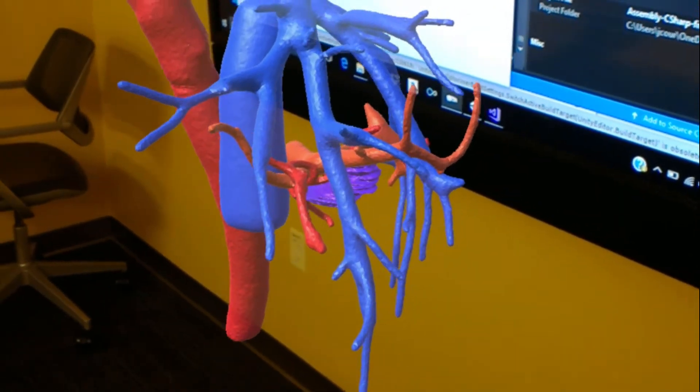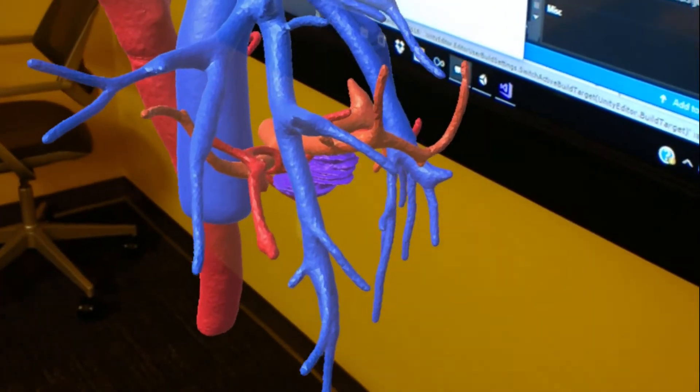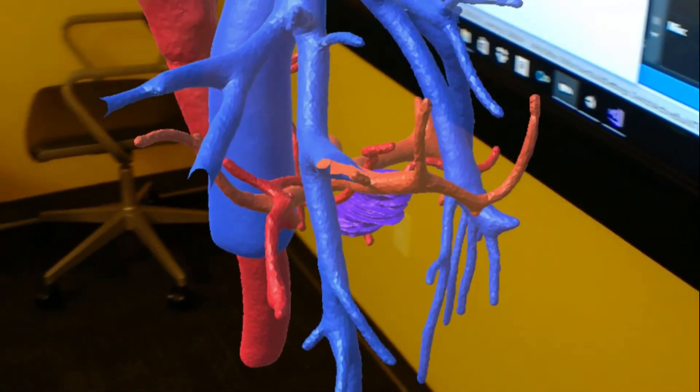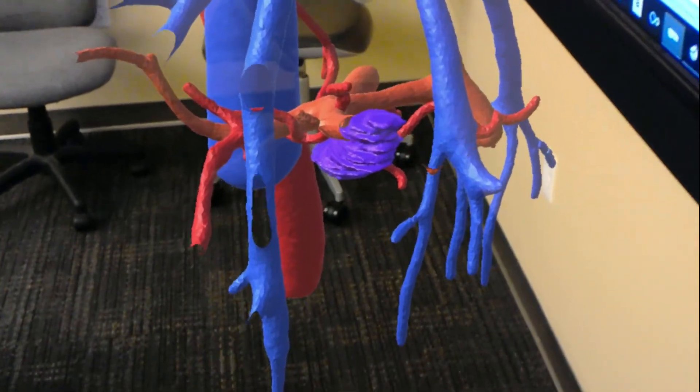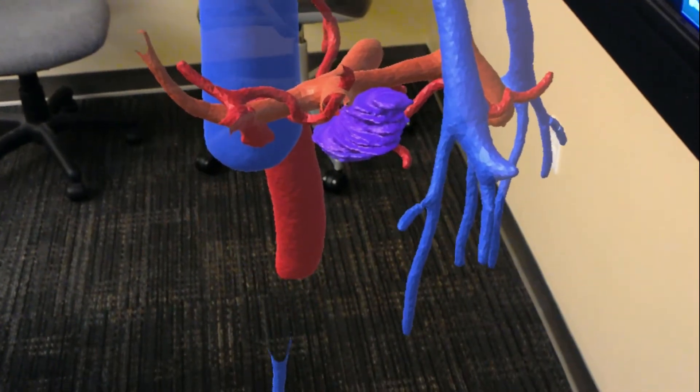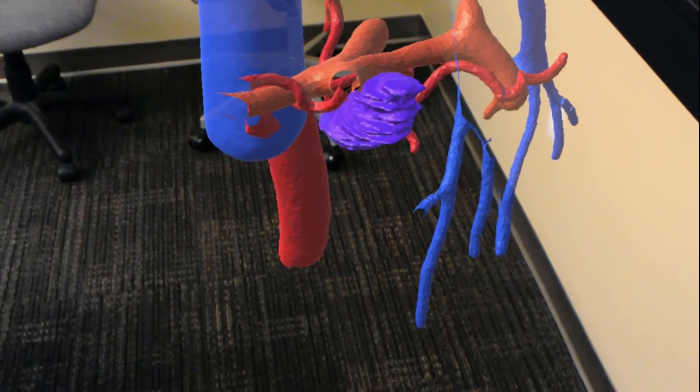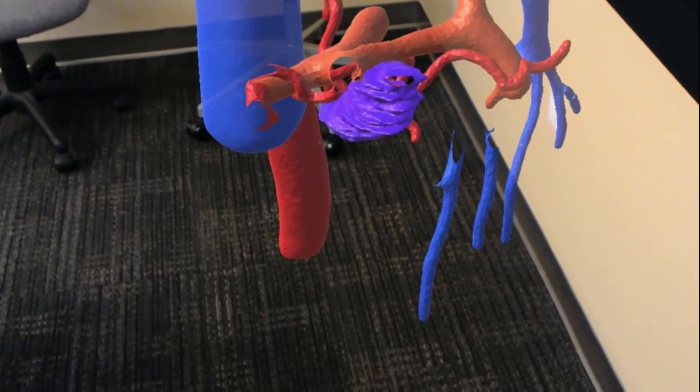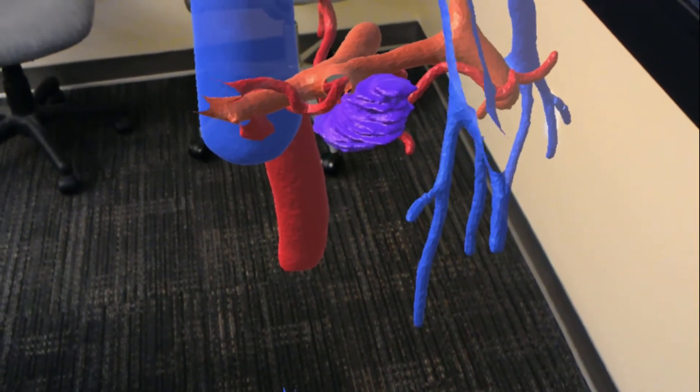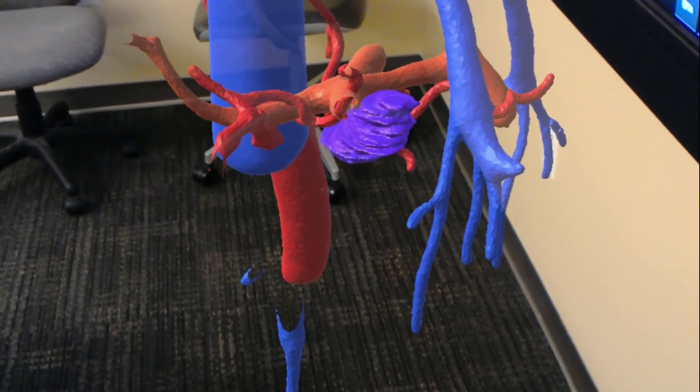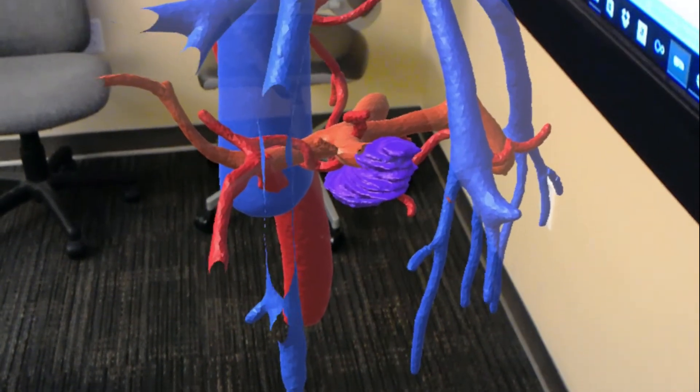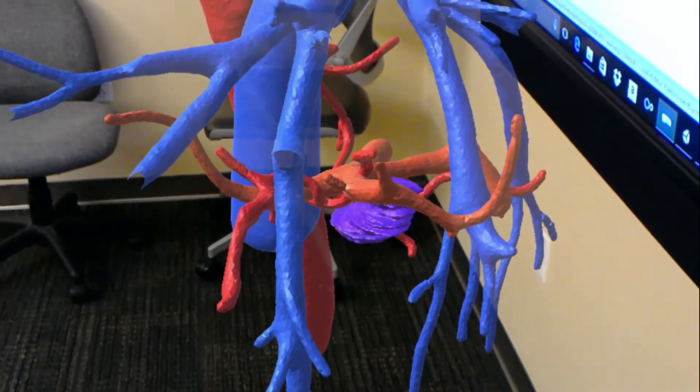Again, we can see it from all angles, and the purple tumor just sitting underneath the portal vein and adjacent to these artery branches.